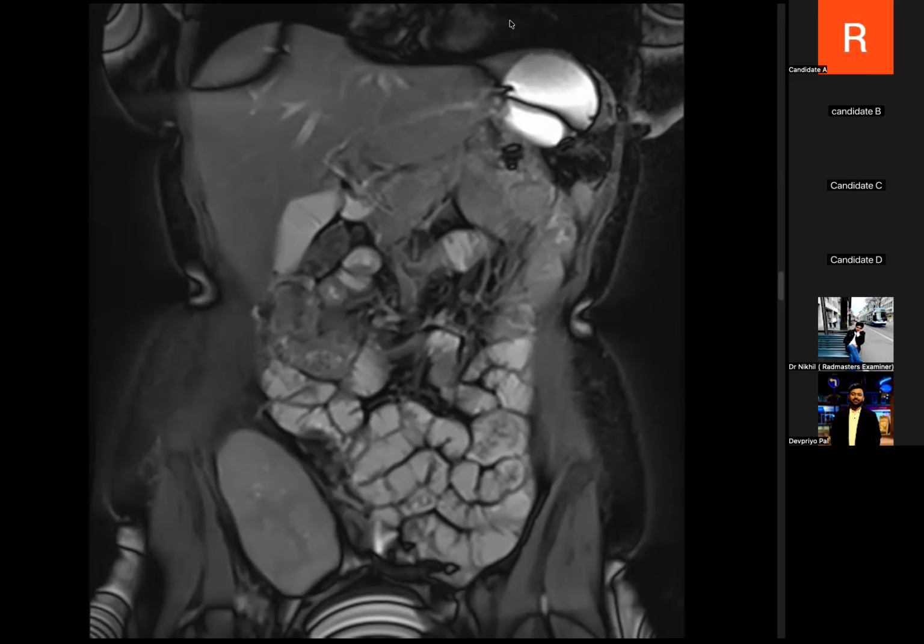So this case was a case of PTLD, right? And you were pretty good on picking it right on spot when you saw a graft kidney. And I think at that point, you scored very high on this case, right? And you were quick to look at the bowel loops in the first instance, and you picked up the findings. So that is really commendable in this regard.